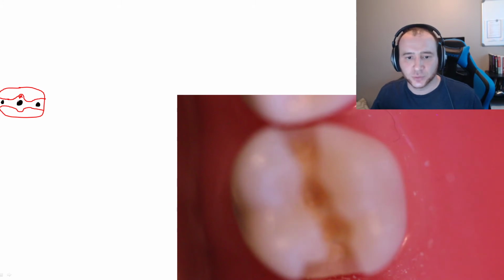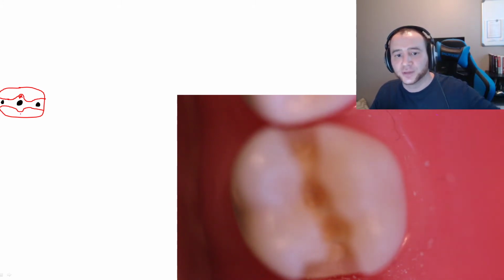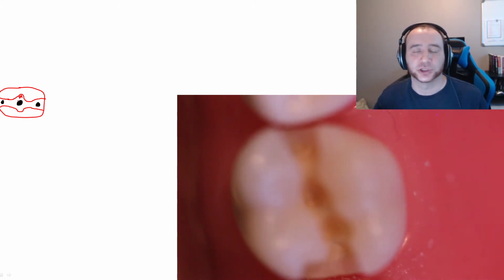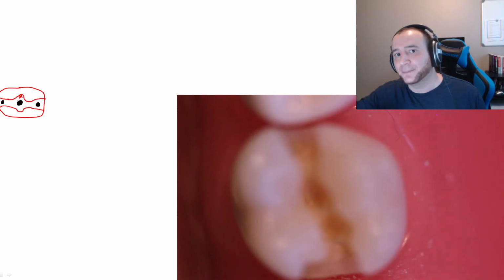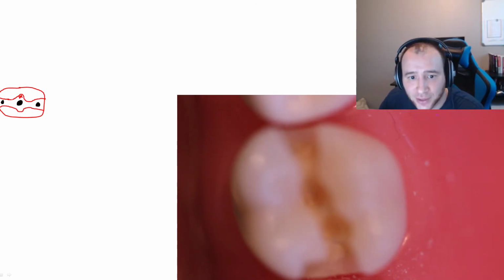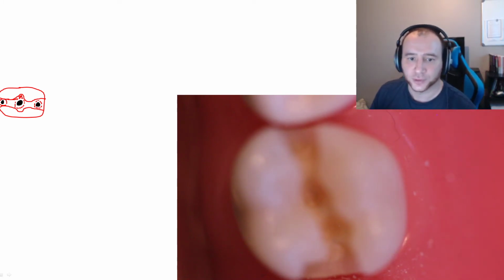Okay, so you extend your outline form to expose the entire carious lesion. That's the rule. So that's why they say based on caries. Okay, so the width is based on caries, meaning that you need to make sure you see sound dentin around all the carious lesion like this. You want to make sure there's nothing in the walls. Okay, and you have to see it just looking from occlusally toward the pulpal floor.